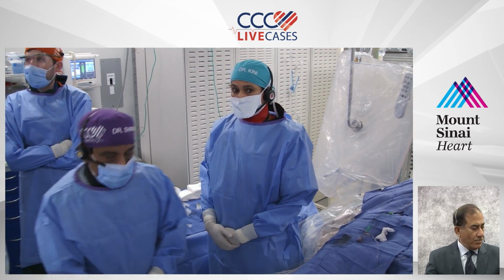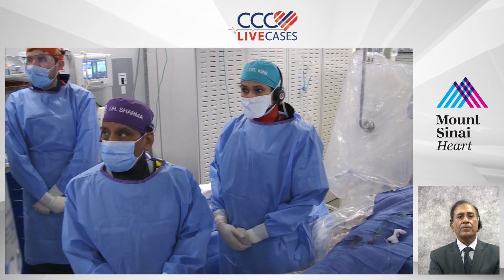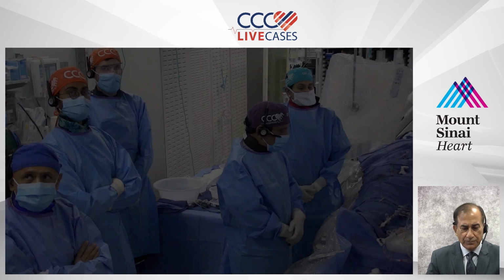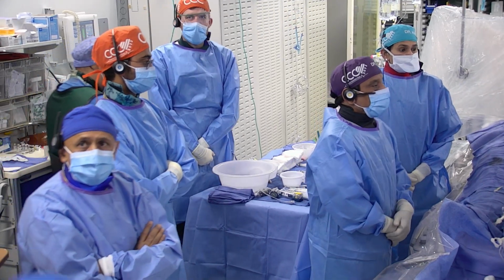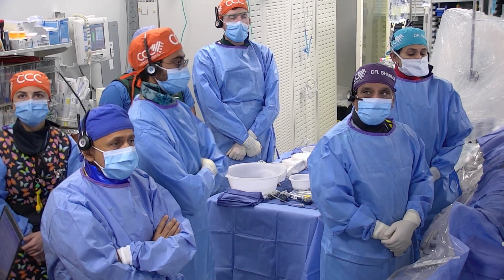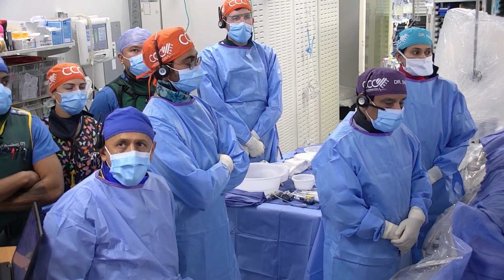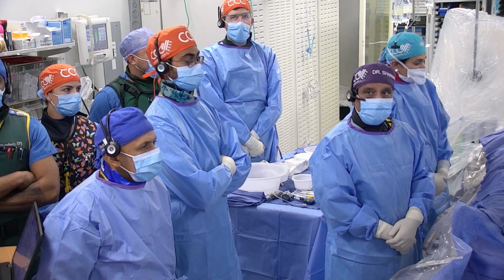Good morning and welcome to our CCC live viewers globally. This continues to have a lot of requests about the CTOs, both antegrade and retrograde. Everybody should come on this side so that we can see in the camera. Yeah, good. The key is that we have taught the entire world about bifurcation, rotablation, calcification. They want to go to the next frontier, and our goal in the next few months will be to explore and show various kinds of CTOs. So that is the goal today.